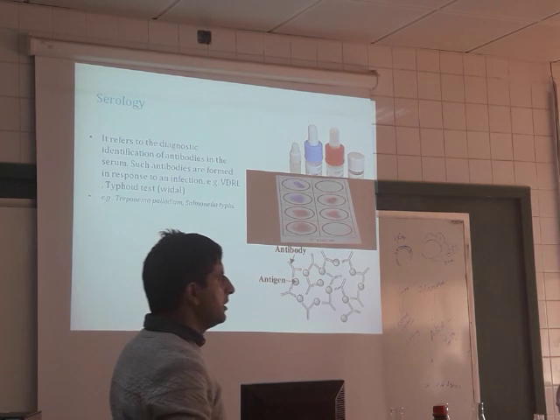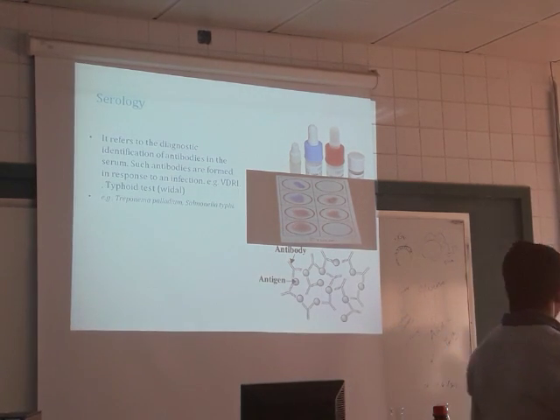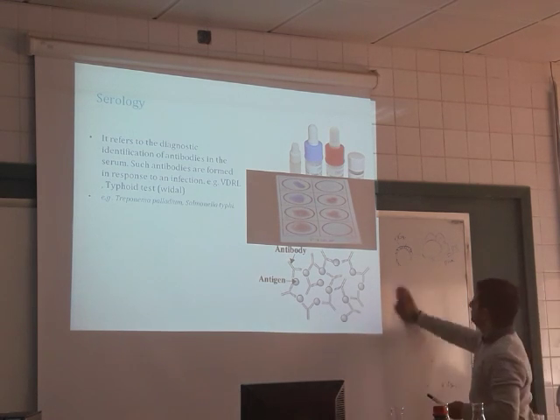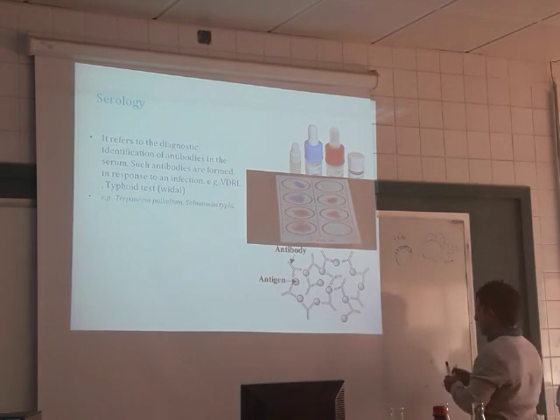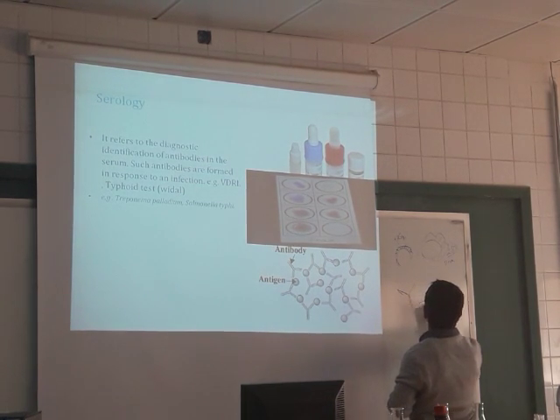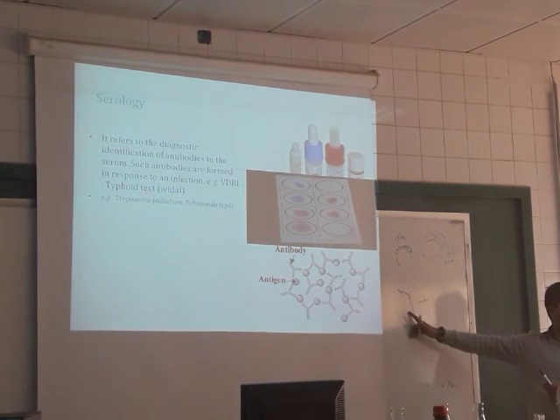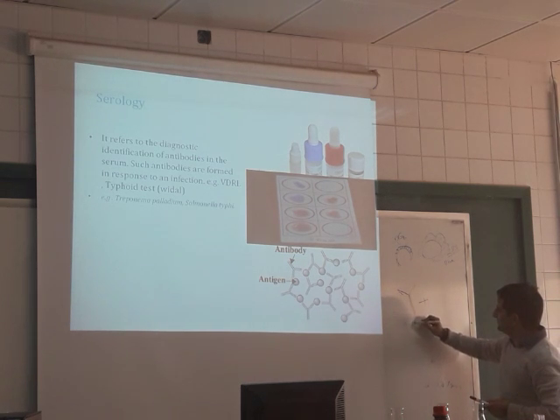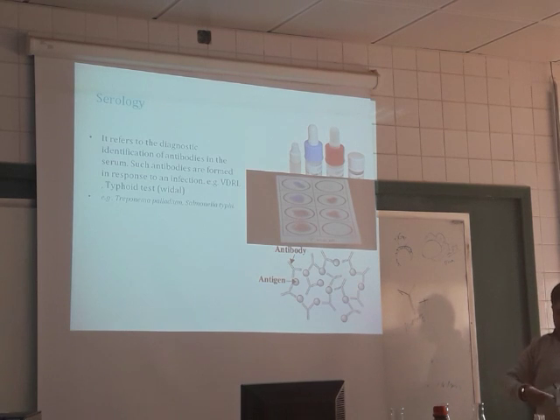This is serology. Serology means antigen and antibody reaction. Antigen and antibody. What is this? This is antibody, okay?